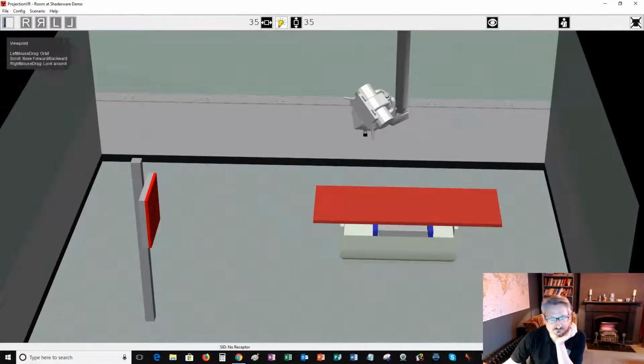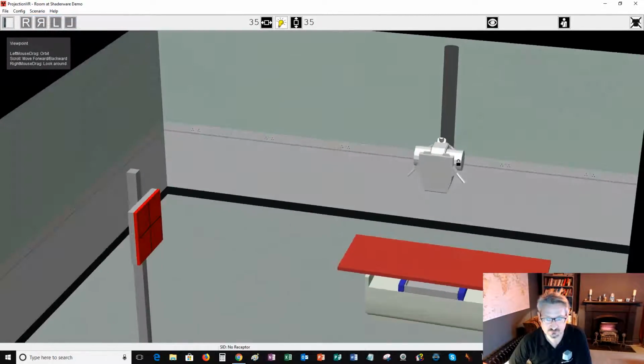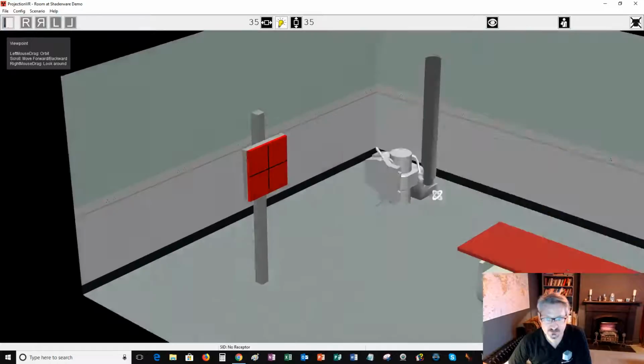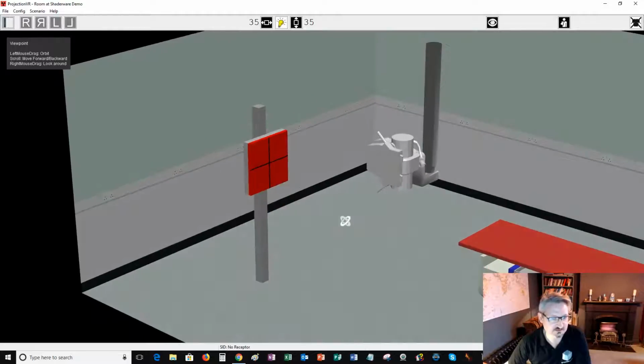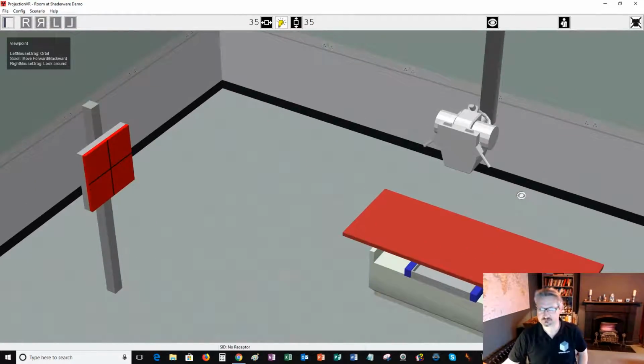So because that's a little bit laborious to do, we've got some shortcut methods to get it back to work standard positions. So if you go over to the scenario menu and click on it, then if you click floating table, it'll automatically go back to pointing at the floating table at the default detent position. And if you go to scenario chest stand, then it will automatically go to point at the chest stand at a source image distance of 180 centimeters, which is standard. Okay, just some quick wins, just to make it quick to get to various positions.